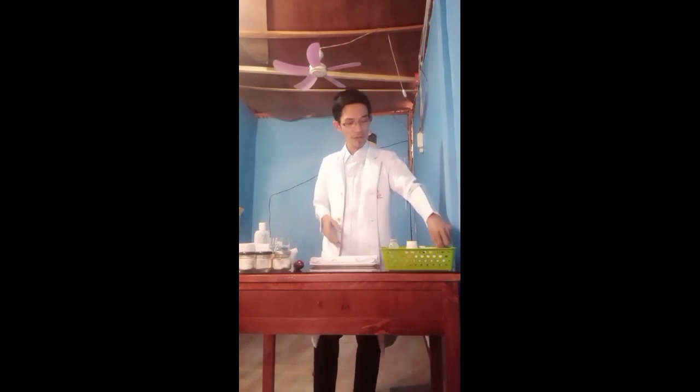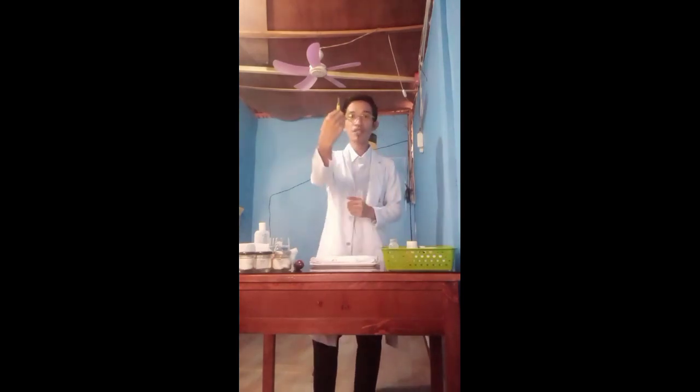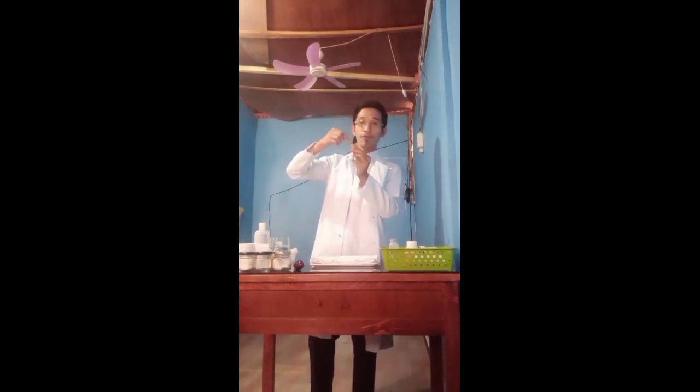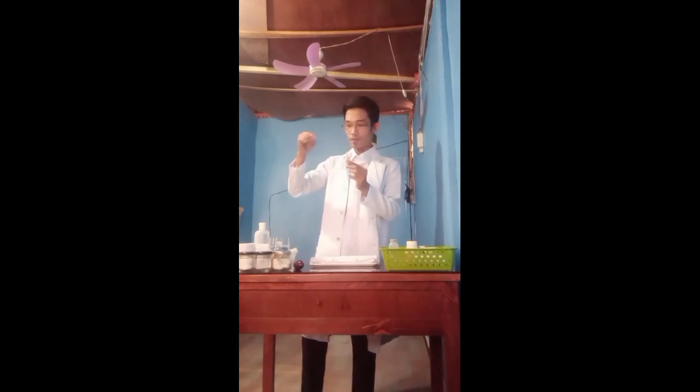Next is preparing the ampule. Tap the top of the ampule lightly and quickly with your finger until the fluid moves from the neck of the ampule. So I have here the ampule already. Here's the ampule, guys, to move all fluid into the lower part of the ampule. So place a small gauze pad or an opened alcohol swab just above the neck of the ampule, to avoid getting injured.